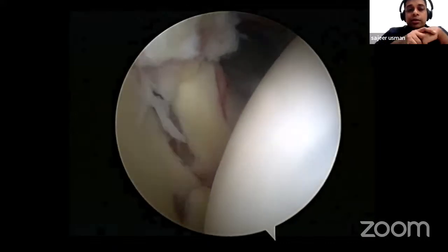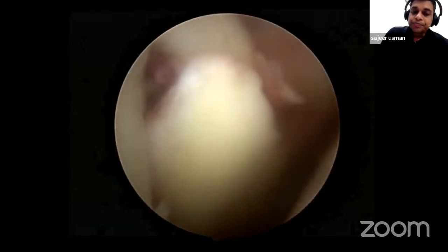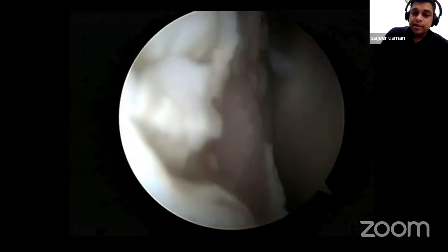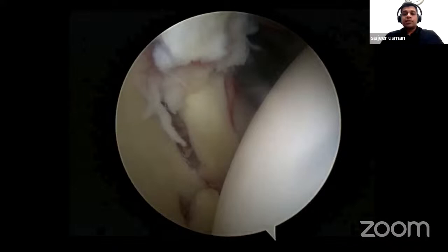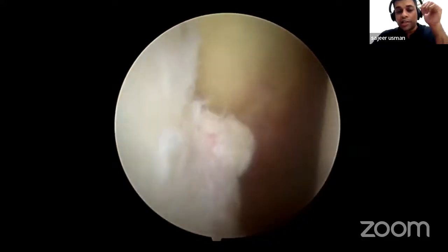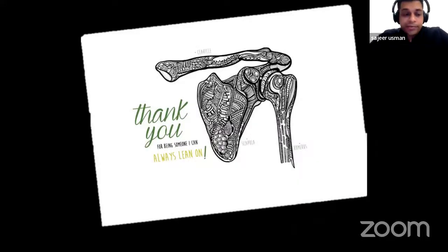But when you have a fresh anterior inferior labrum tear and a large Hill-Sachs, here there is also a large chondral fragment anterior inferiorly and a decent size crater in the Hill-Sachs, which is also engaging, these are cases where you need to apply a soft tissue plus bony procedure. And if you do find a large inverted pear-shaped bony defect or the engaging Hill-Sachs like I showed earlier, those are for Latarjet only. Thank you.